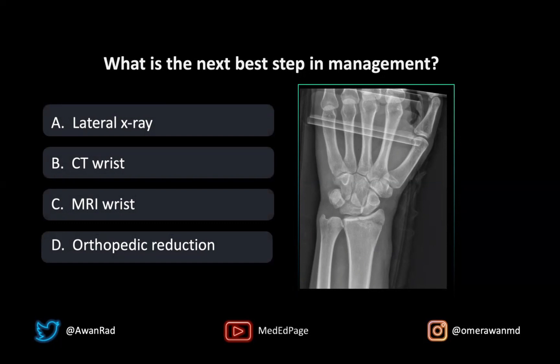Not only is there an intraarticular radial fracture, but this lunate is a little abnormal. The morphology is not what it should be. Usually a lunate will be kind of rectangular or trapezoidal, but here it's pie-shaped. And that indicates that there is some element of carpal malalignment because the morphology of the lunate has changed.